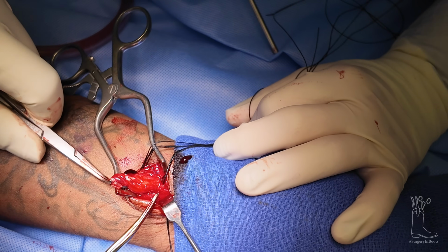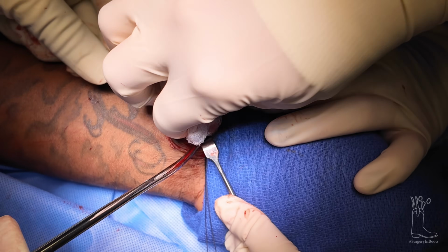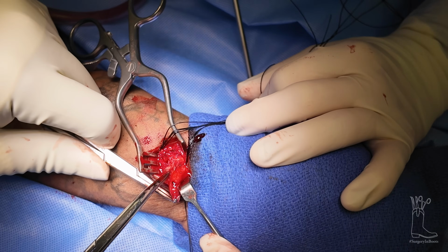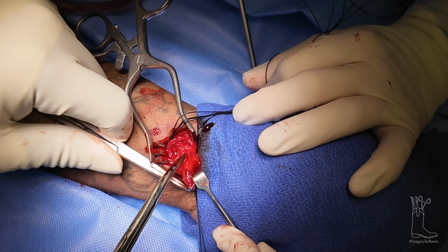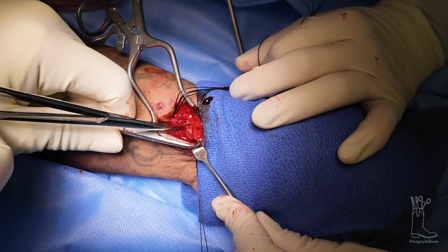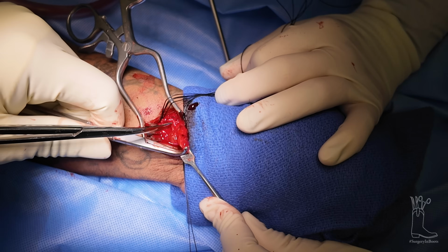You don't like when your surgeon says oops. I'll set it. The reason I'm not using cautery and I'm okay with bleeding is that I also want to make sure I don't injure any nerves or anything unless absolutely necessary.